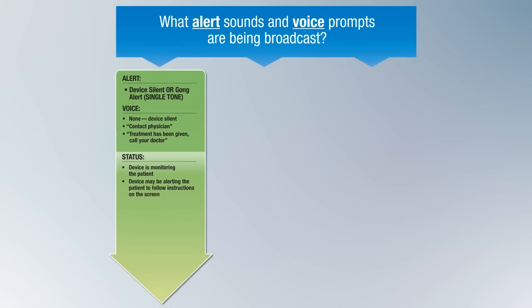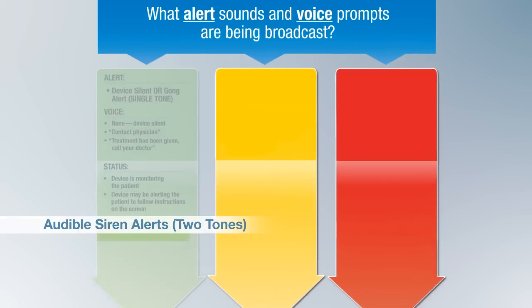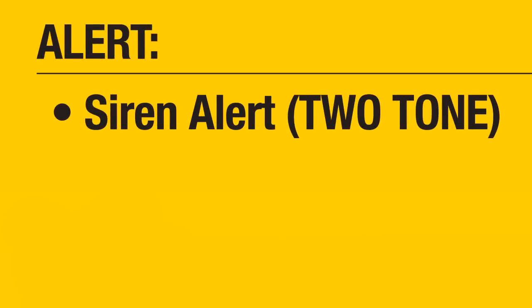If you arrive on the scene and the LifeVest is broadcasting alerts or voice prompts, it is important to pay close attention to these messages. Audible 2-tone siren alerts and voice prompts may indicate that the patient has been treated or is still in the process of being treated. You may hear the 2-tone siren alerts accompanied by one of these prompts.